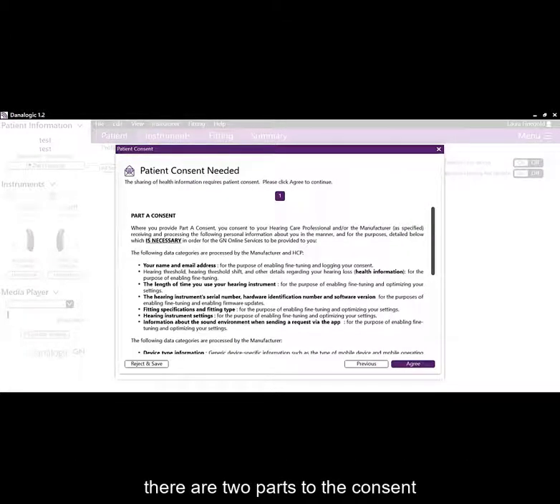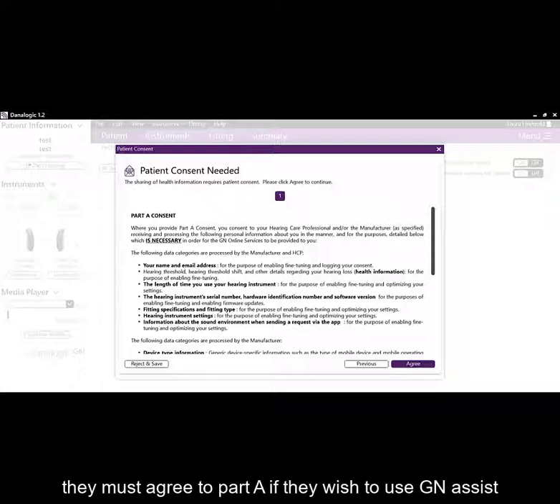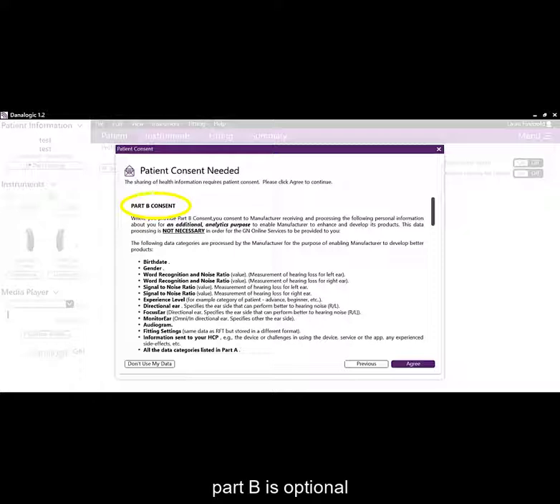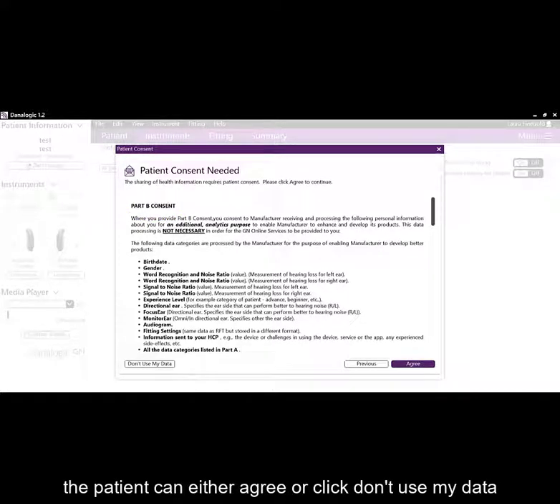Part A is mandatory in order for the system to work. They must agree to part A if they wish to use GN Assist. Part B is optional. The patient can either agree or click don't use my data.